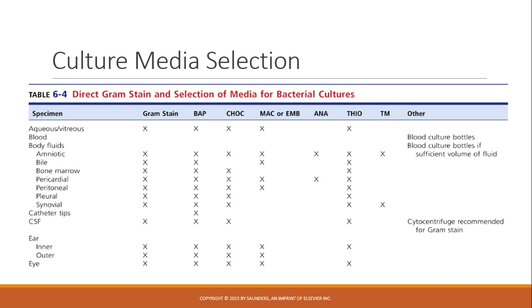I'm not going to make you learn what plates to inoculate for different samples, but just realize that a variety of plates are inoculated, and it changes depending on the source because there are different pathogens at different sources. Okay?